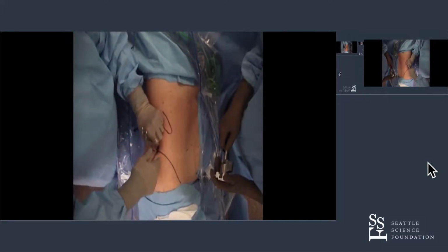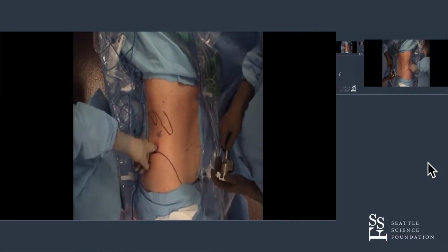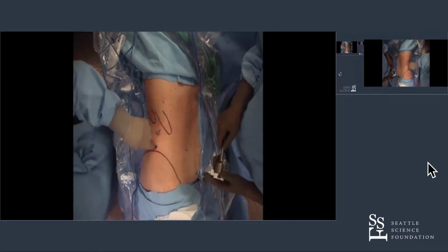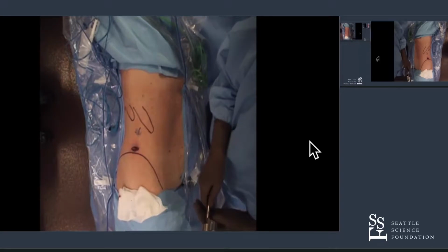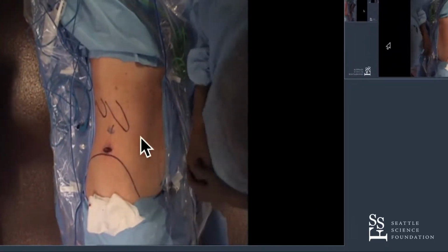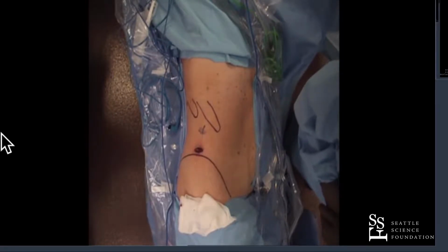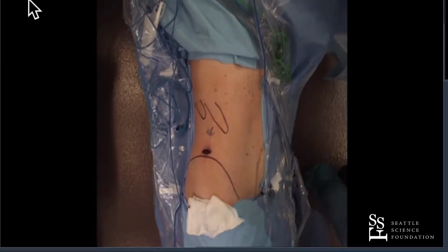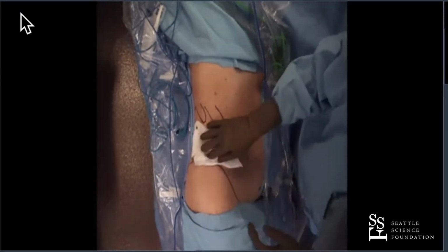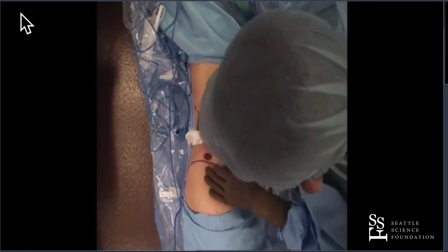And as Jim mentioned, a couple years ago, I wasn't doing retroperitoneal partials. I hated them because I had tried it on the SI, and I was miserable not being able to get the fourth arm. And once we got the XI a few years ago, I've started doing them, and now I just really love it. I look for excuses to do it. And it's saved my butt a couple times where patients just had terribly hostile abdomen. For example, I had one last month where I could get one port in, and I couldn't see anywhere to put any other ports. So I said, all right, we're doing this retro. And it wasn't even a posterior tumor. We just said, hey, we're going retro, and it saved me. Otherwise, I literally wouldn't have been able to do the partial.